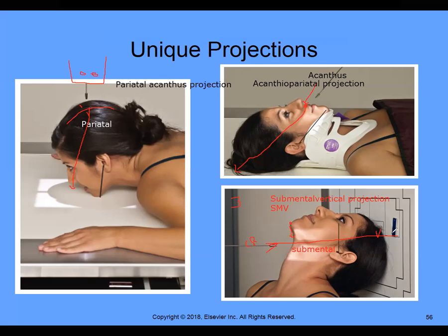So it's entering and then exiting, because again, these are projections that we're looking at.